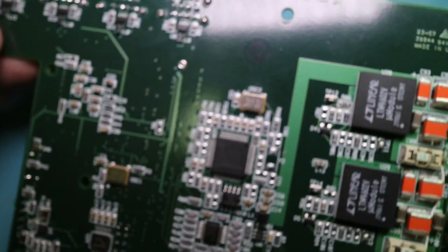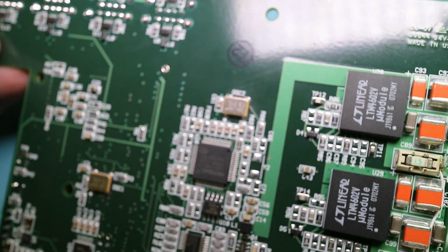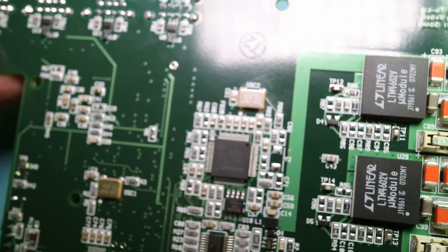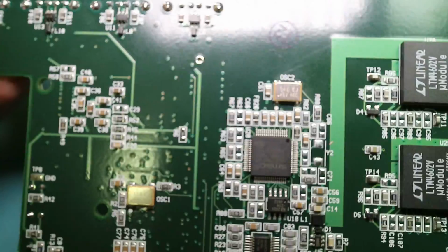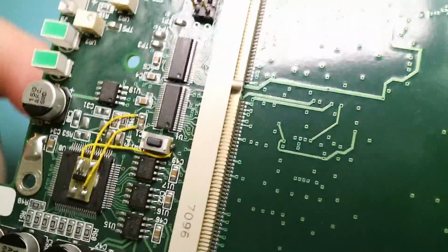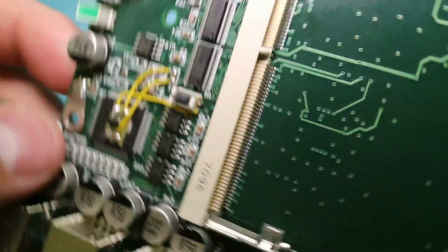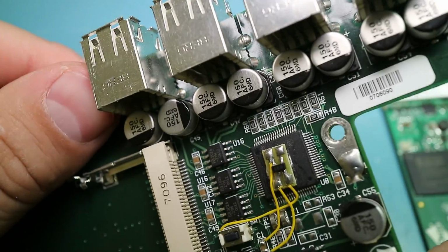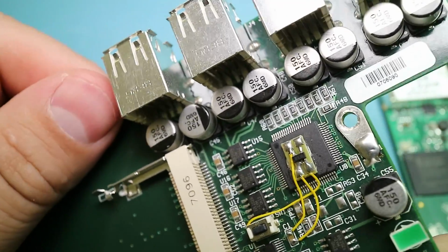I was kind of disappointed by this thing because I was hoping it was some kind of weird medical device. Instead, it's sold to the medical industry, but it's not actually rated for medical use. It doesn't have anything to do with patients. So, a little disappointing, but I've had this thing for a really long time and I wanted to get it torn down.